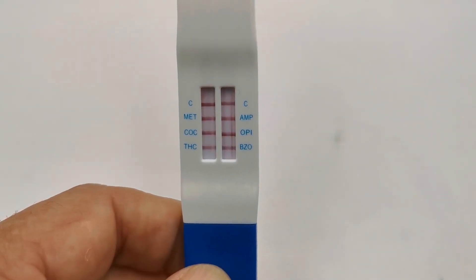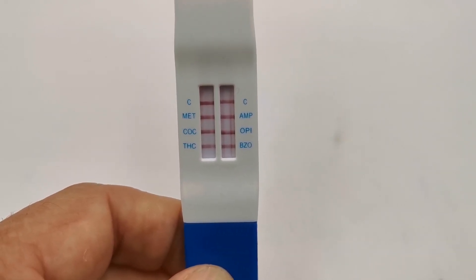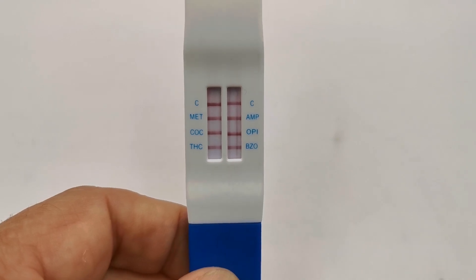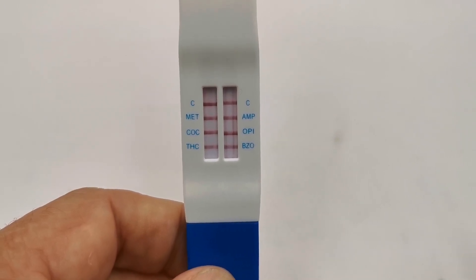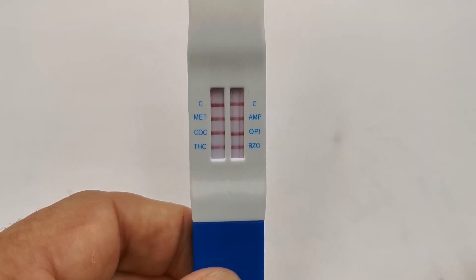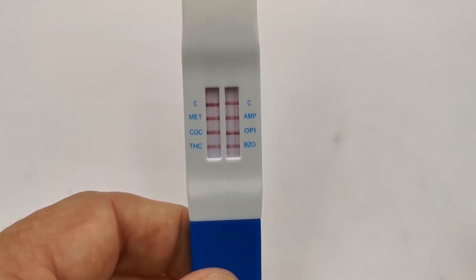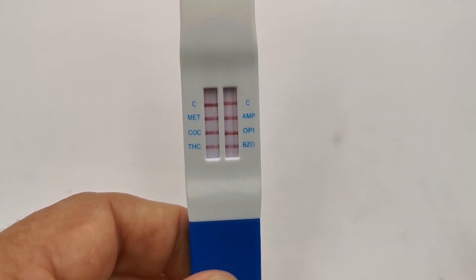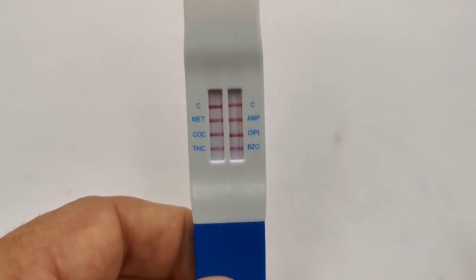You will see some variation in the thickness, colour density, and general thickness of the lines in the control and test regions between the two columns — that's nothing to worry about. Test lines tend to be very thin for drugs such as cannabis, but with this design the manufacturer has ensured a really clear, thick test line for cannabis. A positive result is indicated by the absence of a test line against the drug abbreviation at the 10-minute read time, which is why it's important to give the test 10 minutes development from when it was placed in the mouth.